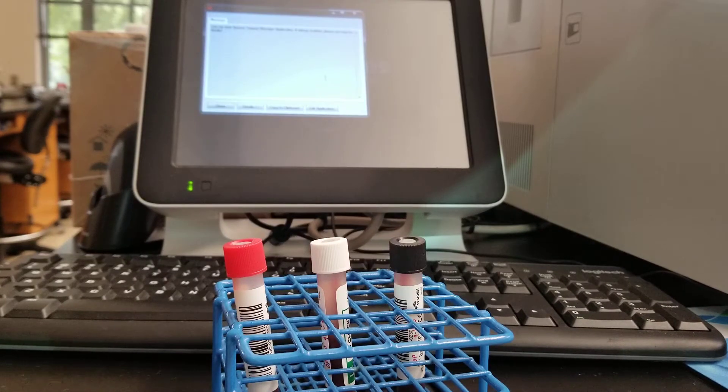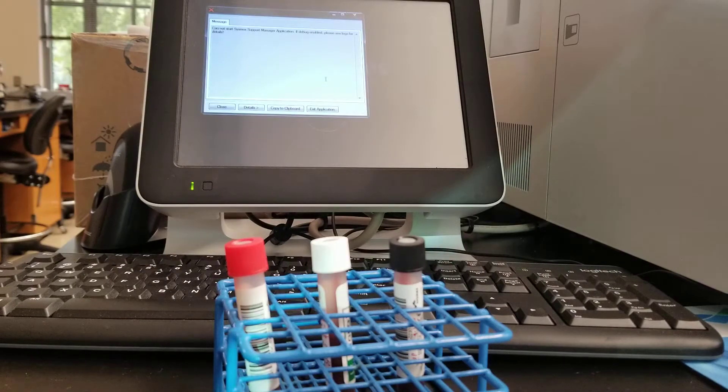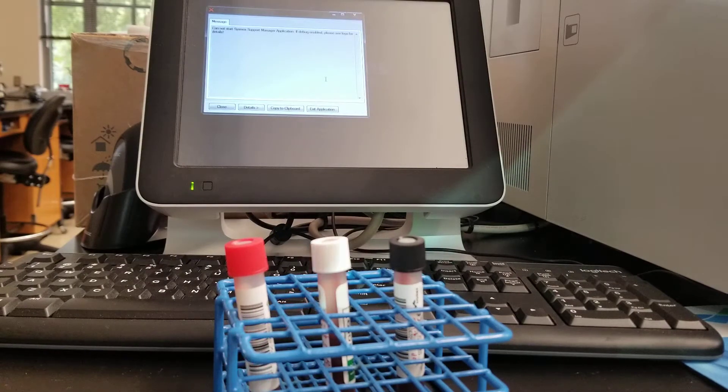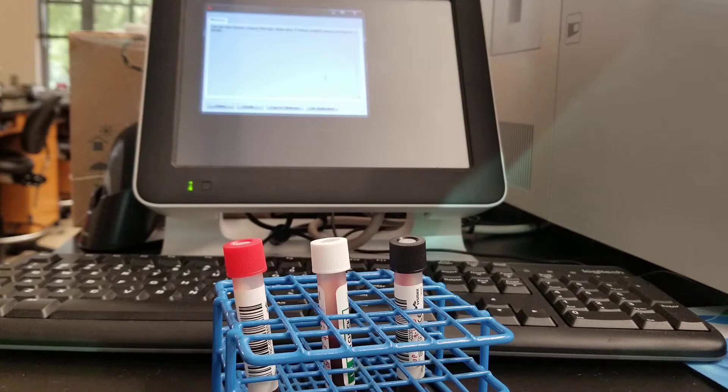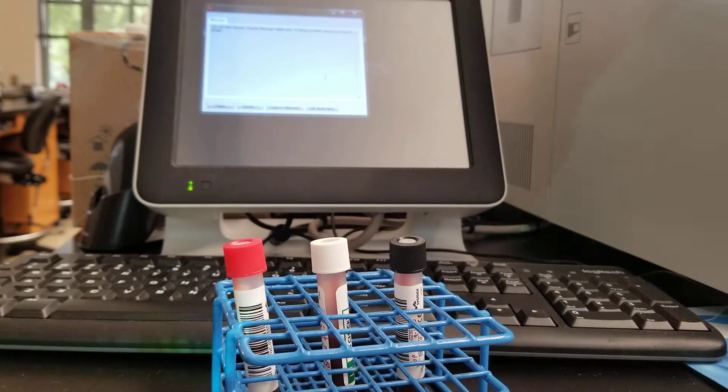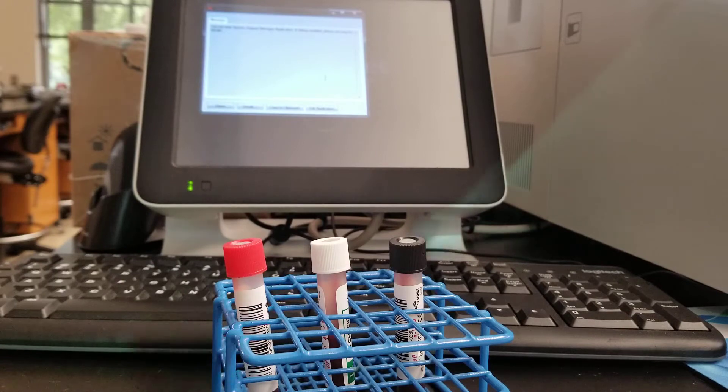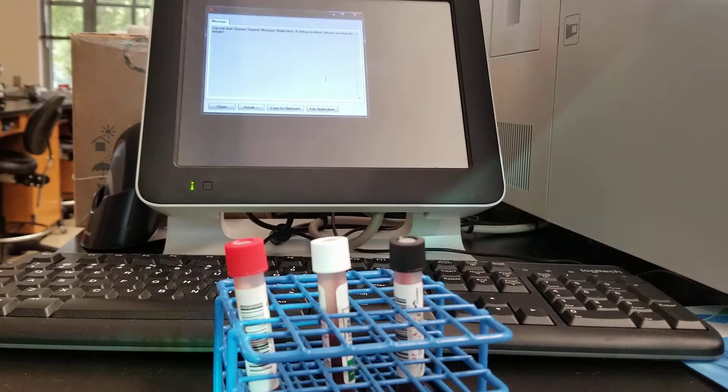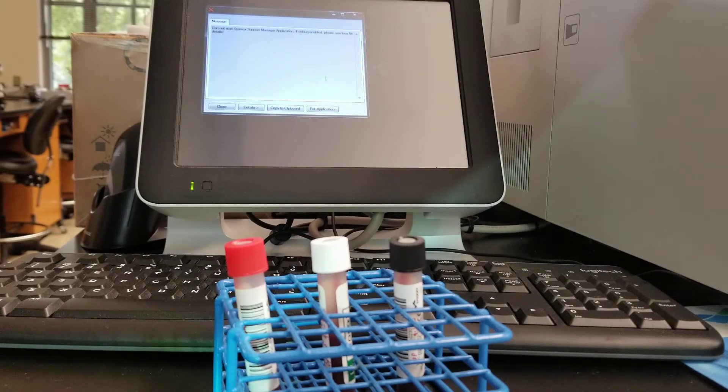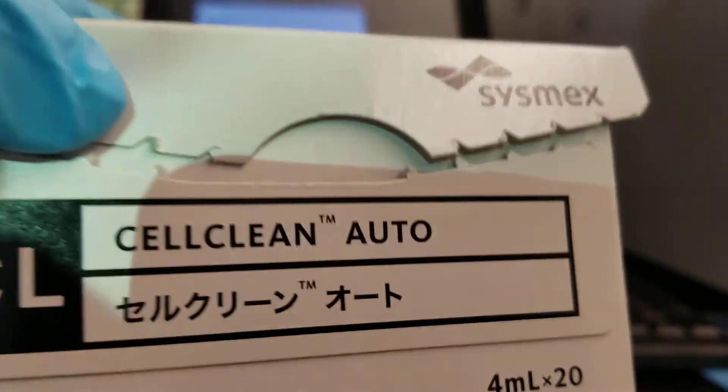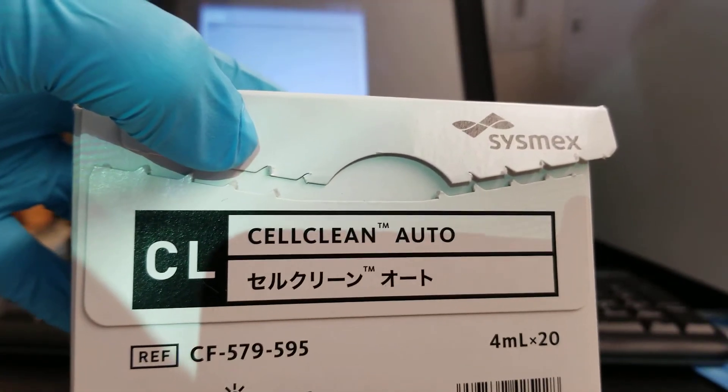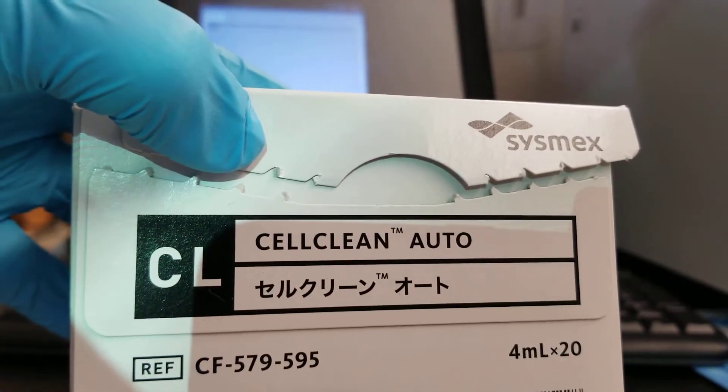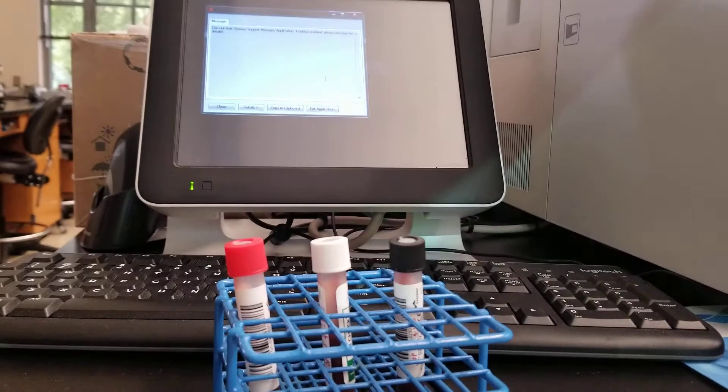We did have this analyzer not in use for a week and so what it's going to ask us to do is to clean it before we start doing anything. To clean it, we have the cell count cell clean auto here and it is 5% bleach.